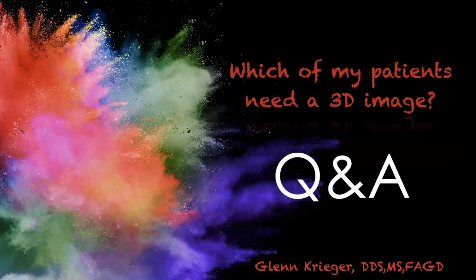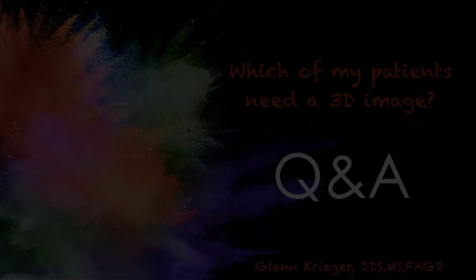When you view the buccal and labial bone level on CT, has that changed your mind about treating with fixed appliances to expand? Not really. I haven't seen anything that jumps out at me that makes me concerned. That's where I defer to the experts, and where I look at the literature. If that's the question, I need to see some really good studies to show me that I'm going to get the expansion of a MARPE that I showed you, or a dome procedure using brackets and wires.